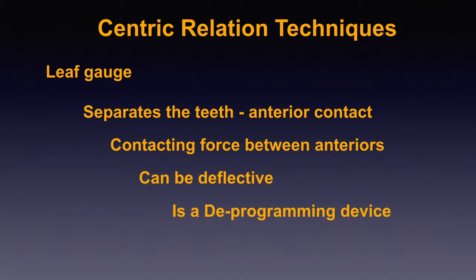The leaf gauge was invented by Dr. J. Hart Long of Daytona Beach, Florida, back in the 70s. Hart was a great friend of my dad's and sent us the very first version with a brass clasp and some acetate leaves. The leaf gauge was taught worldwide by Dr. Bill McHorris to his many study clubs with great success.